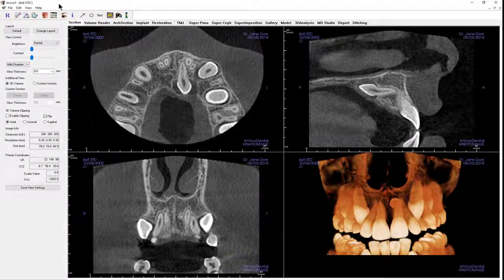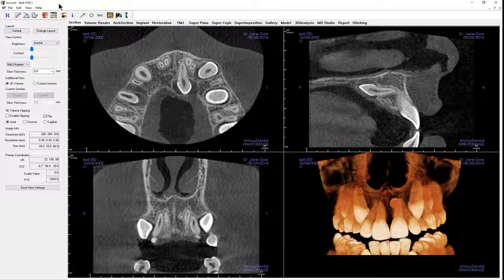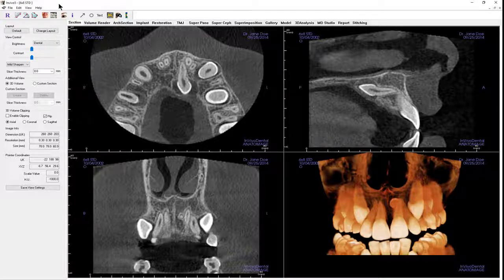While you may not change the originally created DICOM file, you may save any changes or workups done in the software — such as measurements, placed implants, screen captures, etc. — as a new DICOM file or as a proprietary in vivo file.